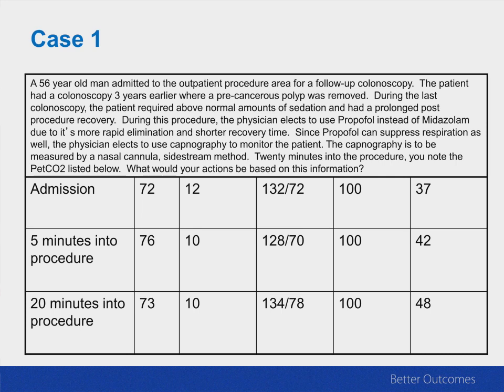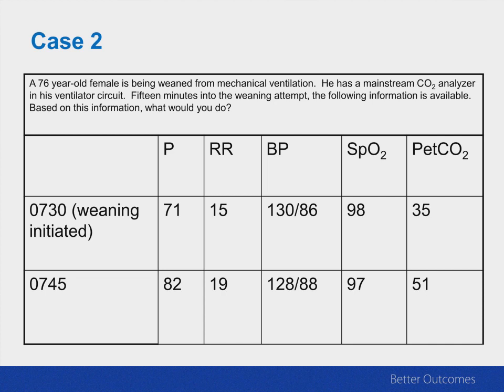fourth column. But notice what's happening to the capnogram. The capnogram is increasing the whole time, and this would be the warning sign that too much sedation has been given. But if you don't have the capnogram, if you don't have that last column, you won't know what's occurring. And so because of that, we really have an issue if you don't have capnography to monitor patients.